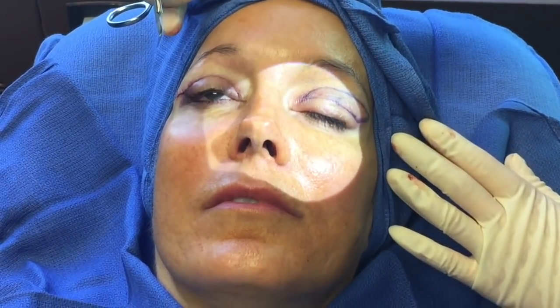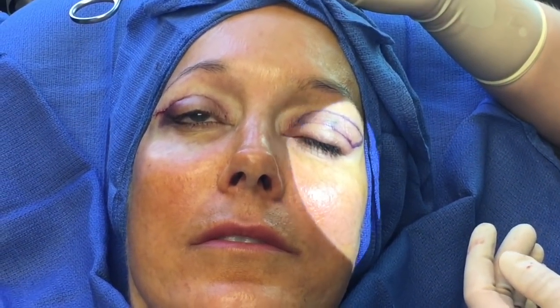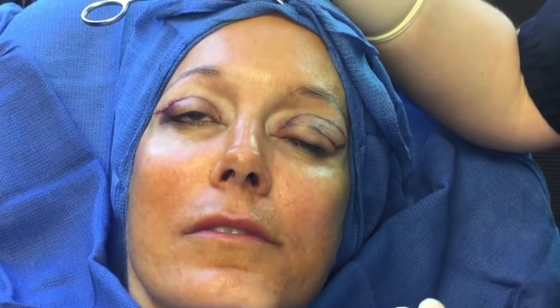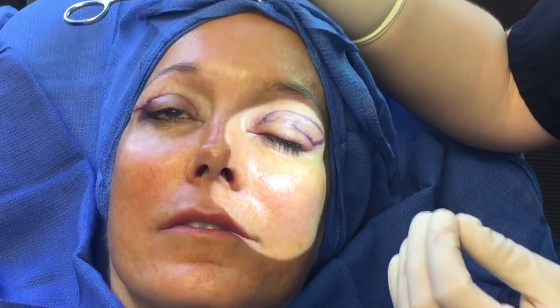I've already completed the right side. The incision has been closed with sutures that are underneath the skin — you can see the little blue knots at the end, and that's the extent of sutures visible on the outside. There's a little swelling, but that'll go down pretty quickly. Downtime for this is around a week and she'll be back to normal activities within a week or so. The eye is a little bit open, which is completely normal due to swelling from the procedure and some of the lidocaine injected earlier. Within usually an hour the eye will be completely closed. I'm very conservative in my measuring to make sure the amount of skin removed is definitely not going to leave the eye open.